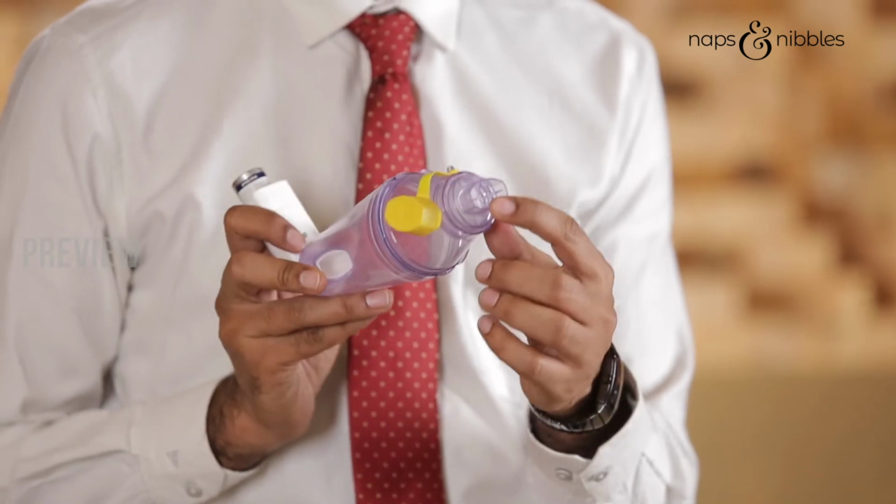In case your child is not able to take deep breaths, then allow your child to take regular breaths and increase the total number of breaths to 10. You can also check to see if you can hear the sound of the valve of the spacer opening and closing. This can be heard like a clicking sound. In case you do not hear it, then you can close the nostrils of your child so that your child takes more effective breaths through the mouth only.